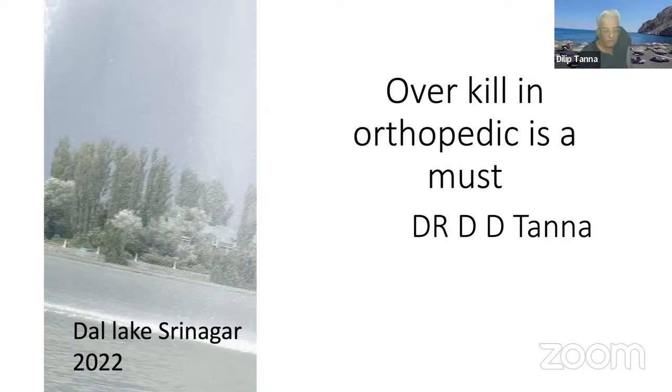What I am trying to tell you is that in the femur, the hand reamers, which are solid, will not be able to negotiate the small curve in the femur. So you will go only up to the isthmus and you will tend to put in a thinner nail. While if you have the power reamer, you will be able to ream properly and put in an 11 number nail, which is the ideal nail for a femur the majority of the time.